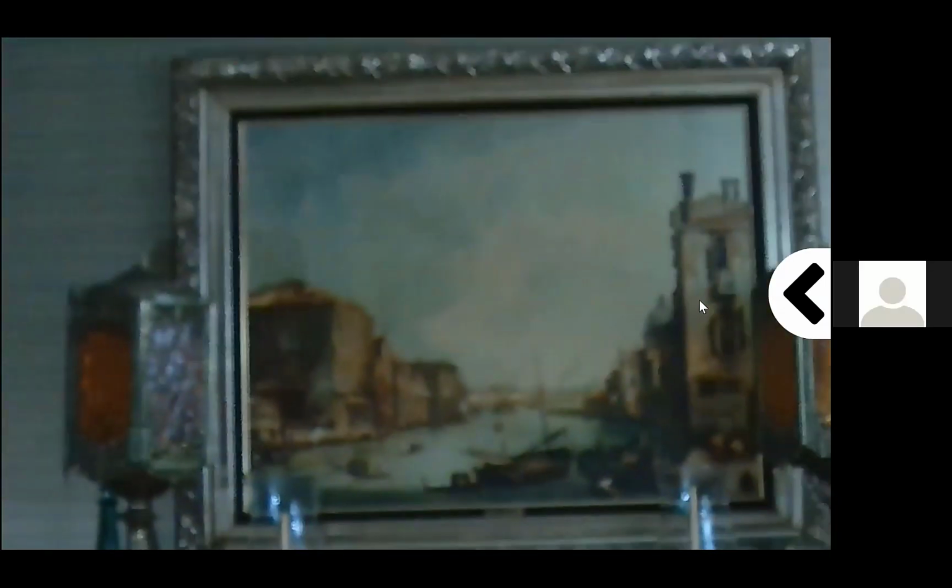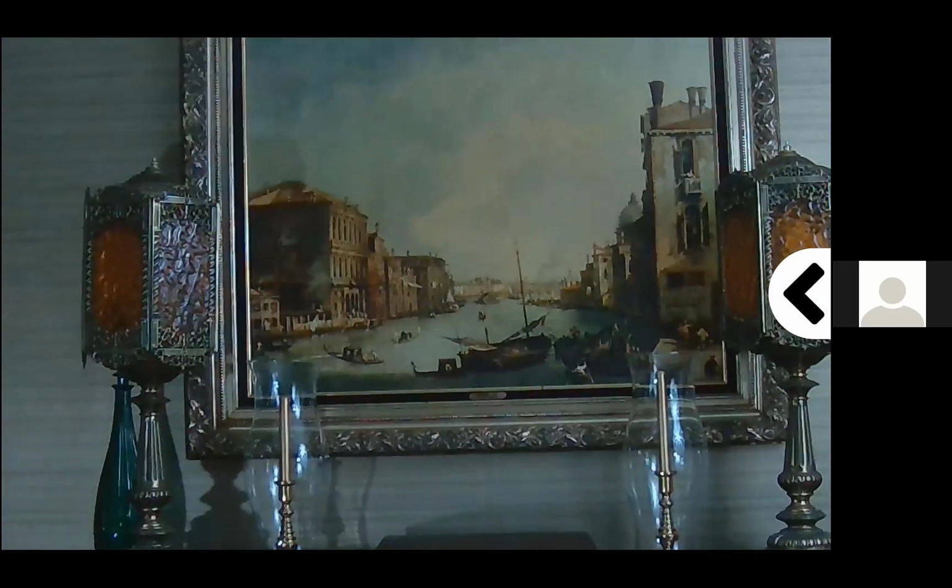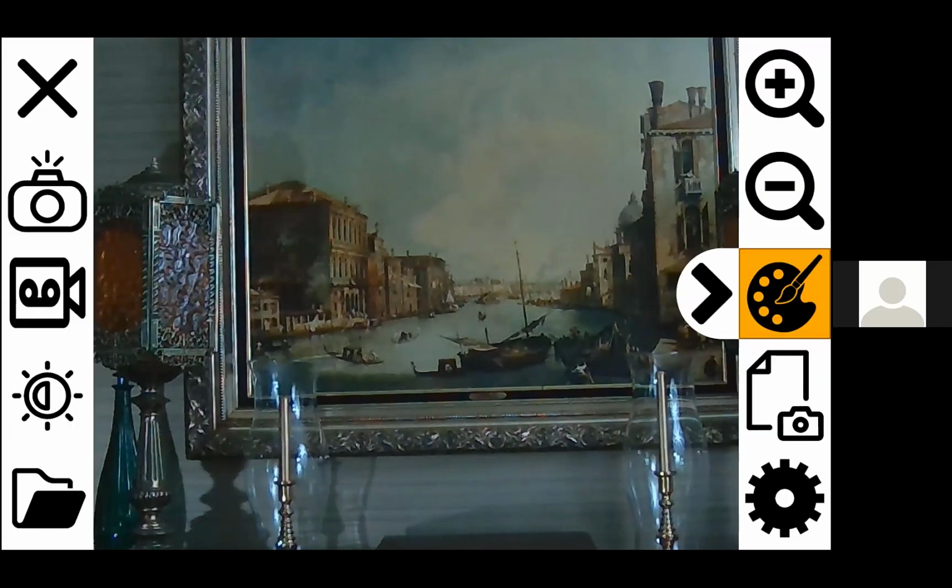So I'm going to flip the camera up here, and I've got across my room a painting on the wall. It's probably about 12 feet away. And you're going to see here, I'm going to click on the plus, and that's going to zoom us in.